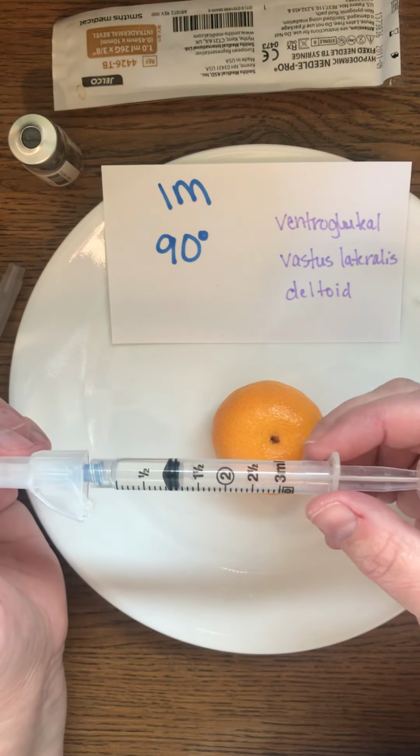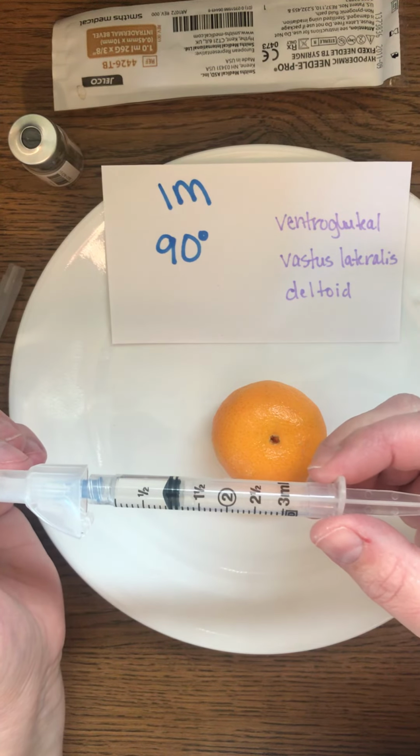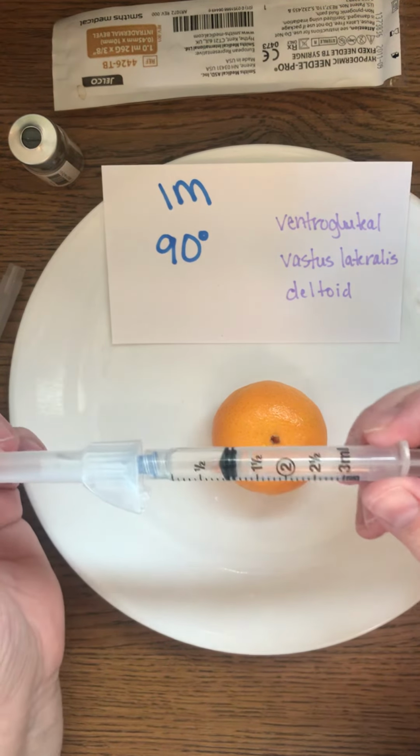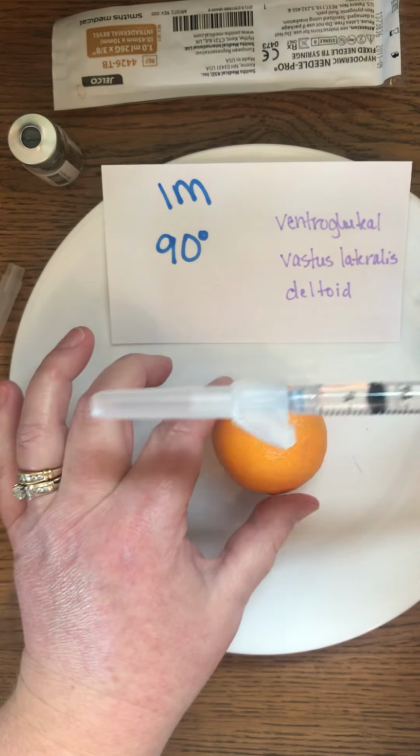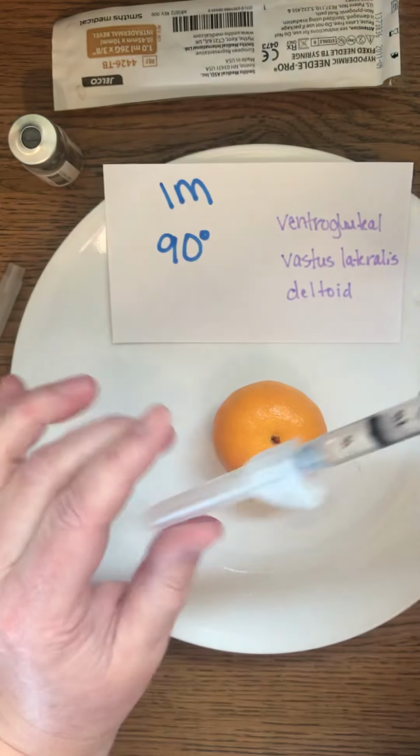So again, the needle is going to be going in at a 90-degree angle, perpendicular to the body. Okay, so if this is our body, we're going to go 90 degrees in, going straight in.